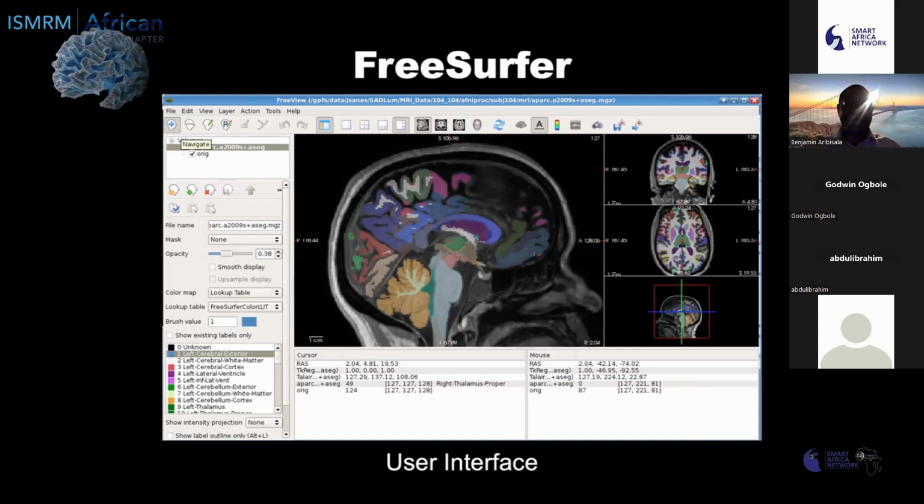The only thing is that it requires an HPC or a machine with very high capacity because it taxes the machine. It's computationally intensive, and that is because the processes it does sometimes target top accuracy, and that requires a lot of machine power. So that's FreeSurfer.